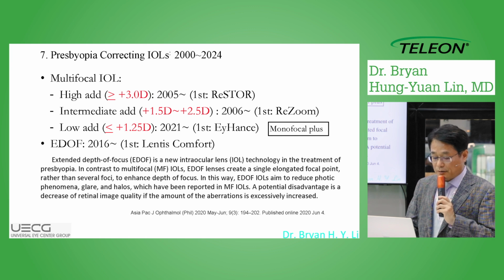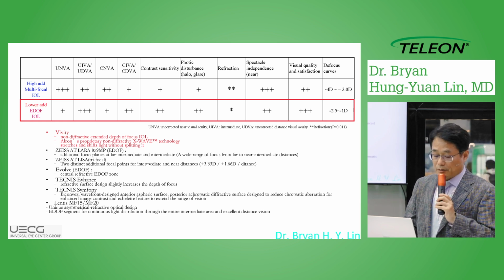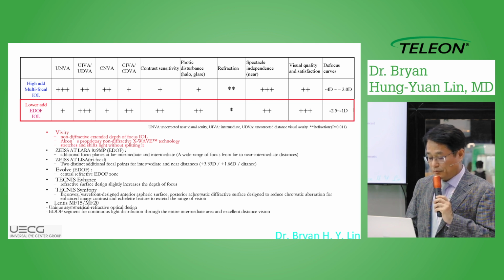Lentis Comfort is the first EDOF IOL on the market. This table demonstrates the advantages and disadvantages of high-add versus low-add presbyopic IOLs. In general, low-add presbyopic IOLs offer better quality of vision for patients with reduced light loss, halos, and glare.